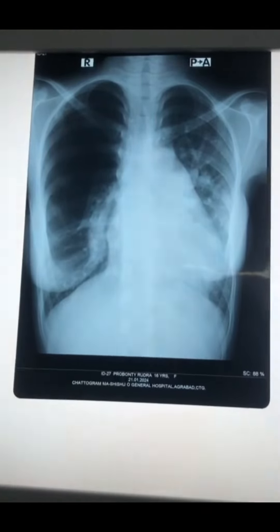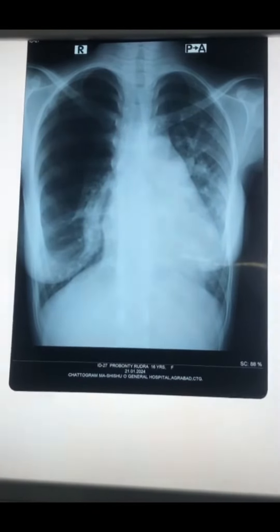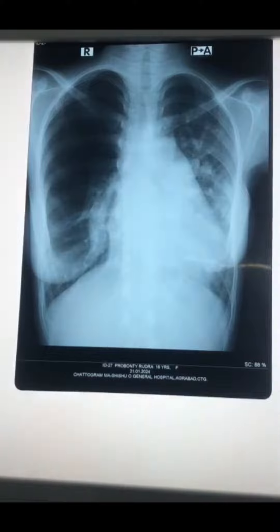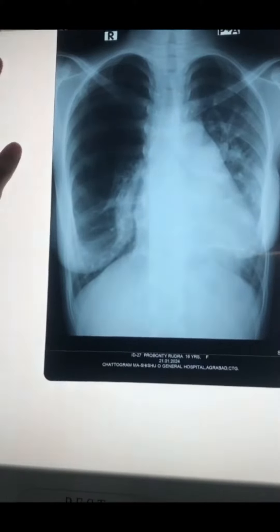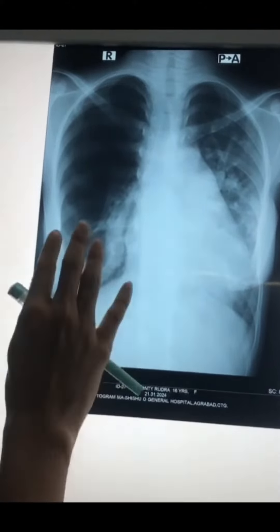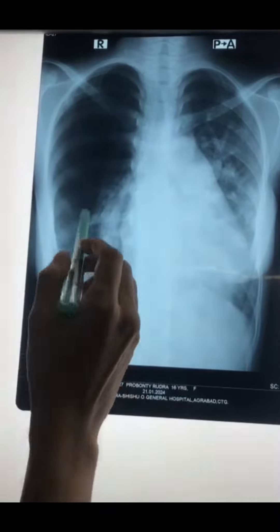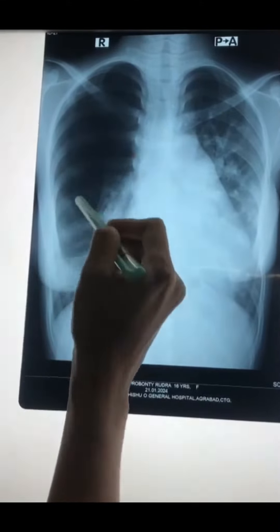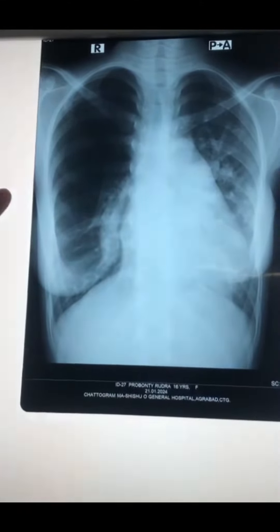Assalamu Alaikum. This character is interesting. This is the chest PA view. Here we compare the right lung and left lung. You can see the right lung has a hyper-translucent shadow.